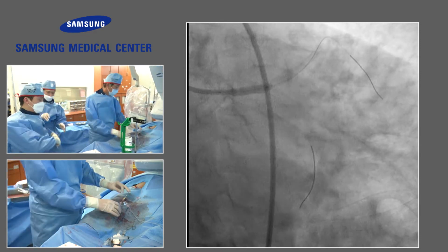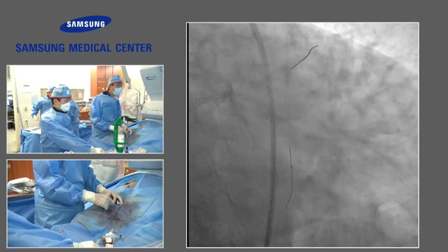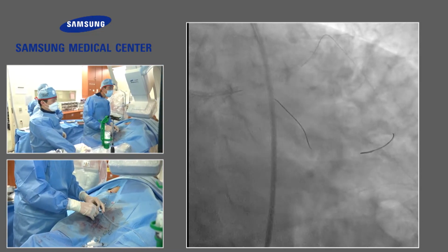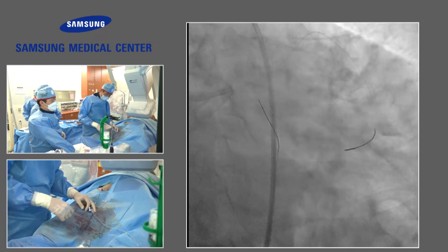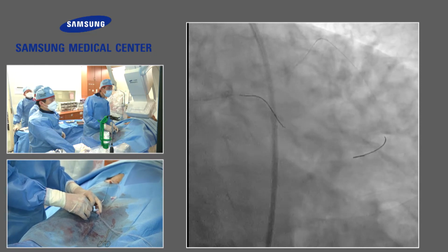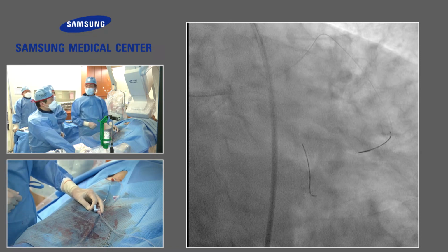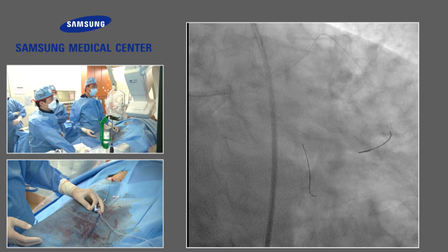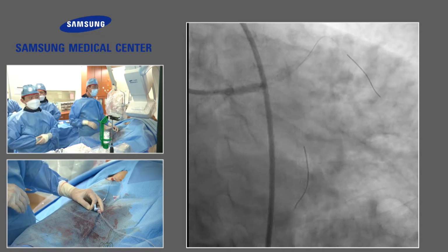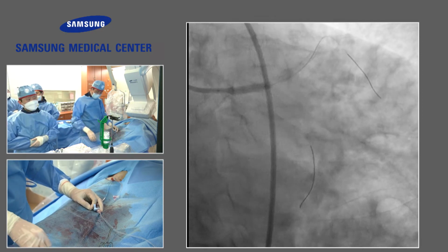Now you are doing a very cost-effective procedure, not using the high-pressure balloon. Okay. Good. It is not recommended for an interventionist who does not have much experience. I'm not sure. So now we have the challenge to rewire the circumflex. The optimal approach is, okay, let's do the optimal approach: 4.5 balloon post-dilation, then rewire the circumflex. Before that, please show us the angiographic appearance.